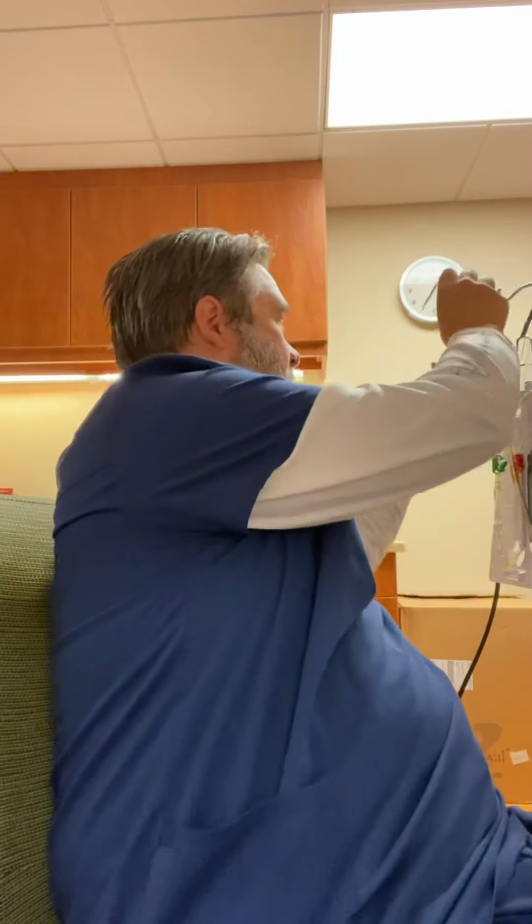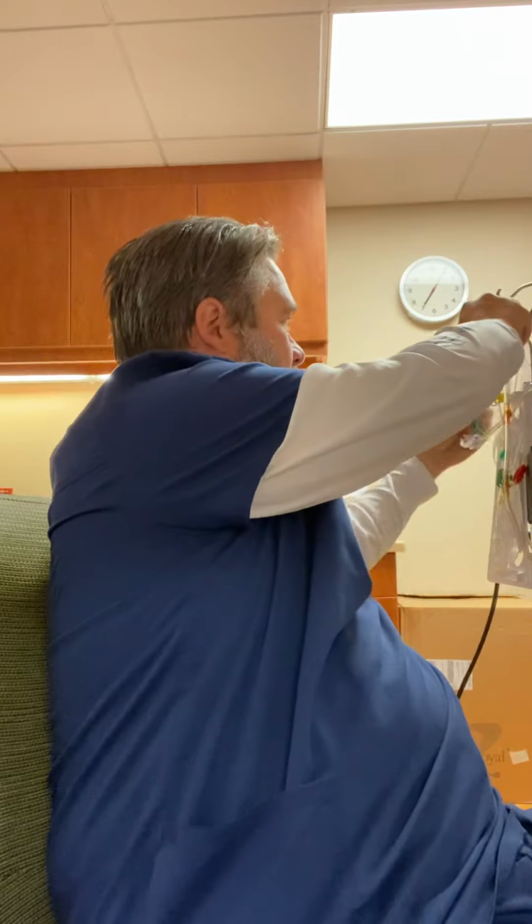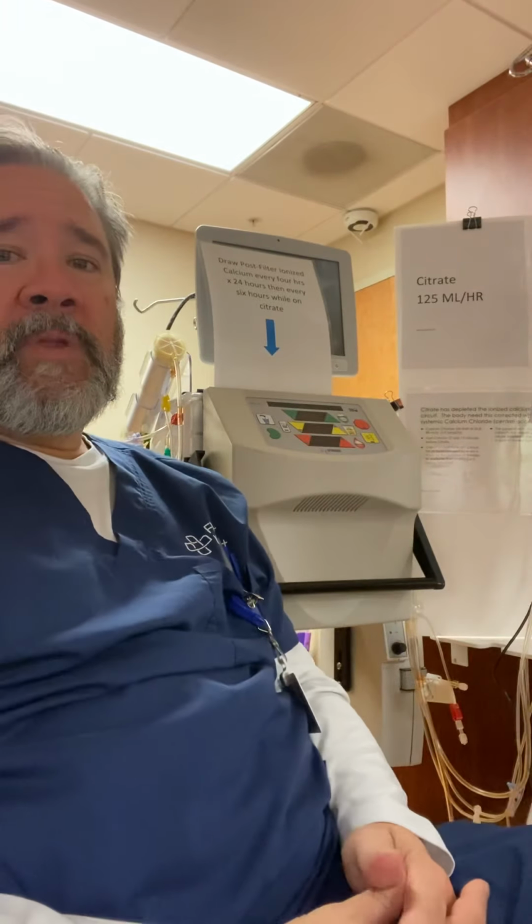That itself isn't always enough either. Oh, by the way, if we're using regional heparin, we're still checking the patient's PTT, looking for a normal range. So it would not affect the patient. Most of it is dialyzed down. If someone has contraindication to heparin, we have to make adjustments. Then we have another option. We have citrate as a regional anticoagulant.